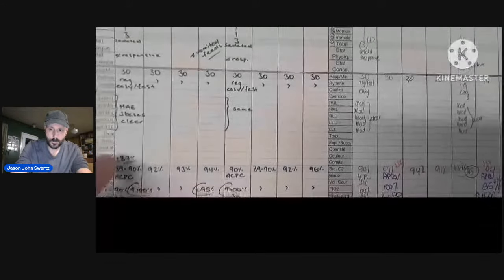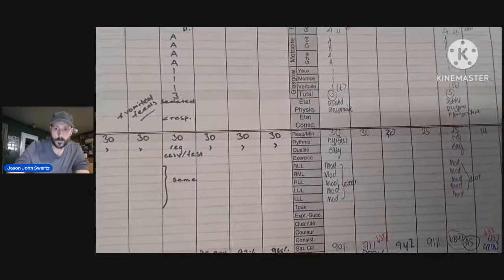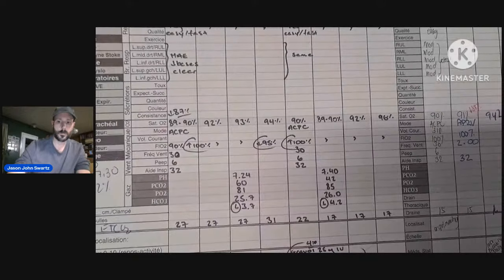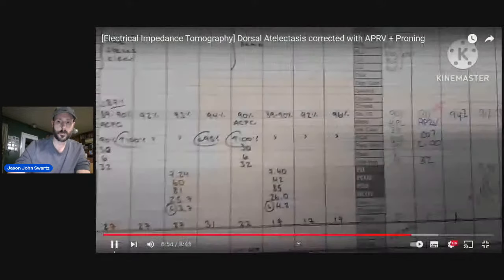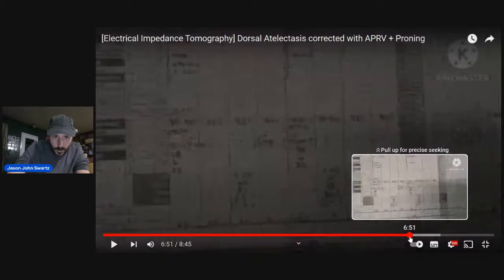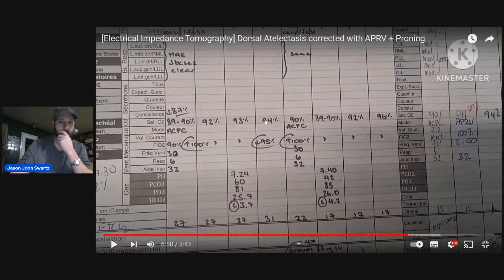This is yesterday, and it was similar to previous days. Respiratory rate was high at 30, and the blood gases with an AC/PC were acidotic. Let me see over here. Slow it down. Okay. All right. So this was midnight. I work day shift, so I arrived right here. You see me in the morning at 9. Switch. So it was on AC/PC, 89, 90 sats.